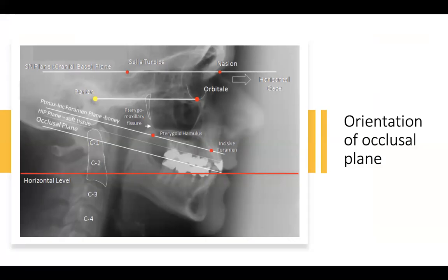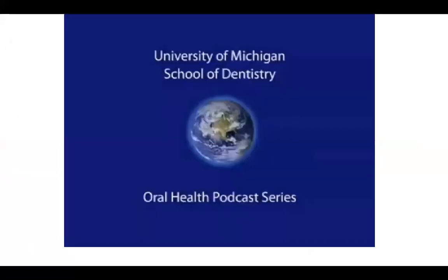So in reference to that plane, the occlusal plane can be in this orientation, can be in this orientation, or can be a little steeper. It depends upon the orientation of the occlusal plane. And this you will determine when you record the orientation relation record, which is the facebow record. That is when you are going to modify your occlusion according to that. So these are the five important aspects of setting up of teeth, and we need to take care of it.